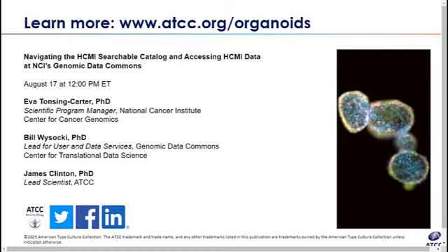Yeah, and one thing I'd like to add on that is, we're talking about the three components, Wnt, R-spondin, and noggin. Our kits do have noggin in it as an individual vial reagent. If you used the noggin we supplied and that media that makes noggin, is that maybe too much in your final growth media? I don't know. If you did go that route, you could simply not use our vial, but that's just something to take into consideration.